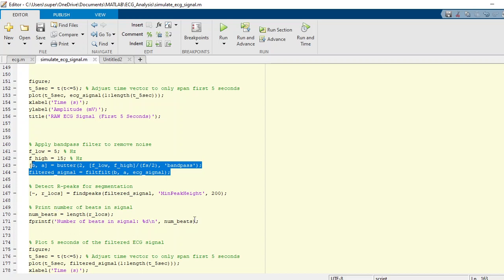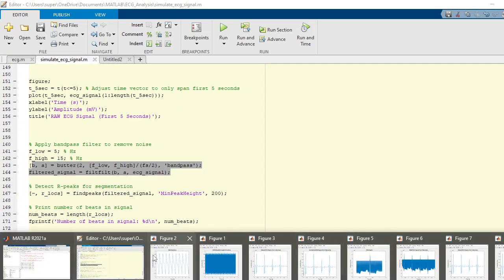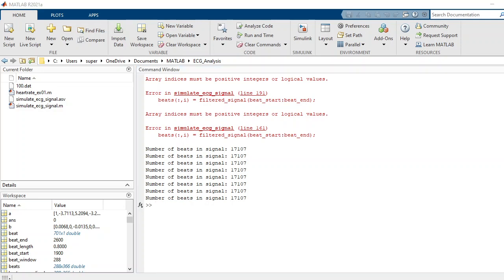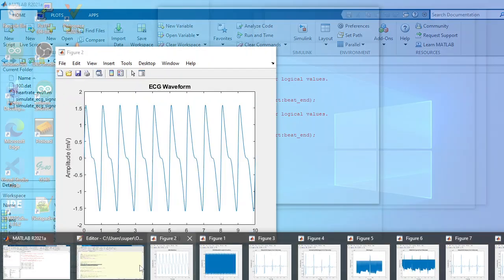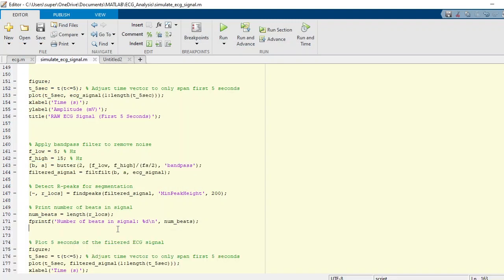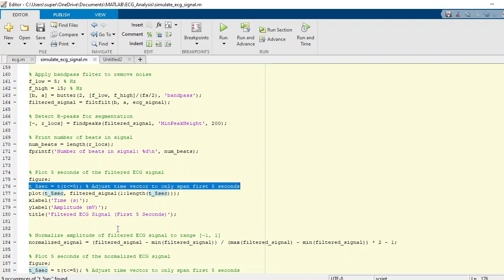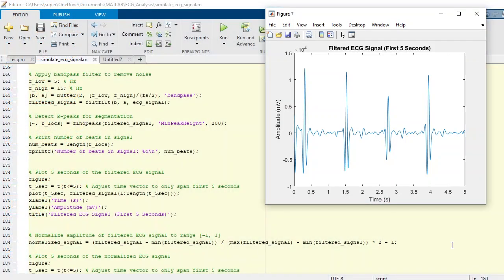We can simply print out the number of beats we have in our file. In our case, it's something like seventeen thousand beats. When we scroll down, you see here that we are simply windowing five seconds of data from the filtered signal and we are plotting the filtered signal.